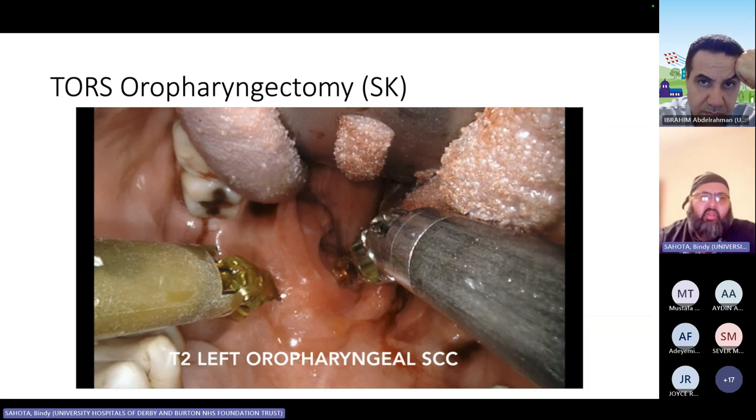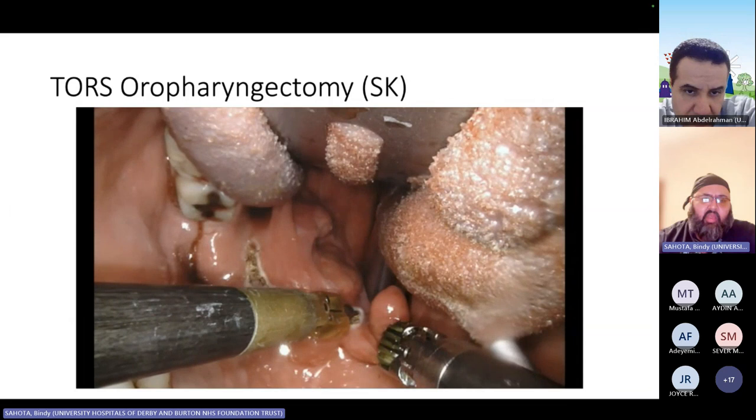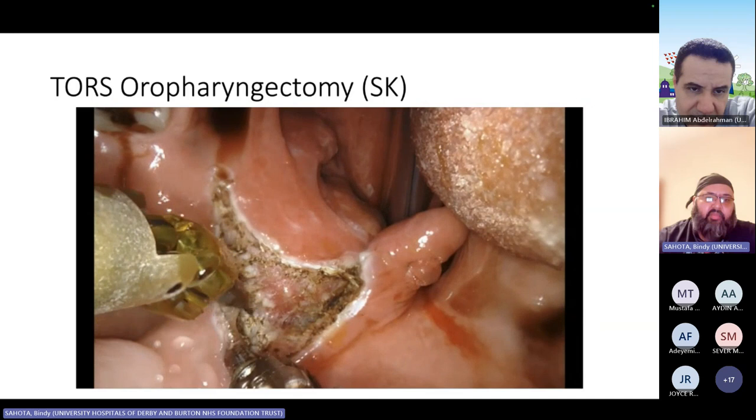First, making the incision over the pterygomandibular raphe and opening it up there. The superior margin, I often find is an easy place to delineate. I will then come across. You're going to come over the actual palate and separate it from the uvula. You can take off a little nub in there. From your lateral aspect, you want to basically chase that down and find your median raphe as you come down.